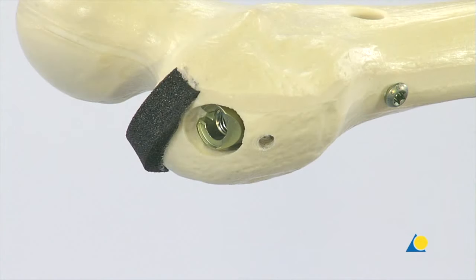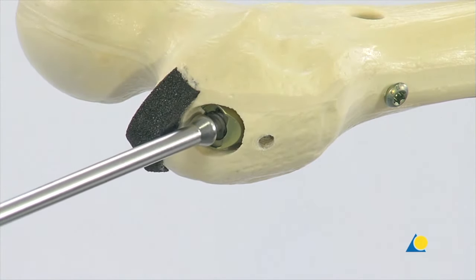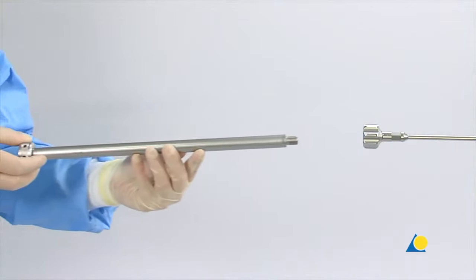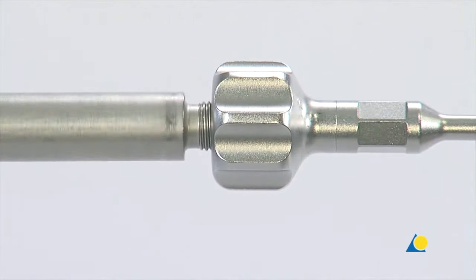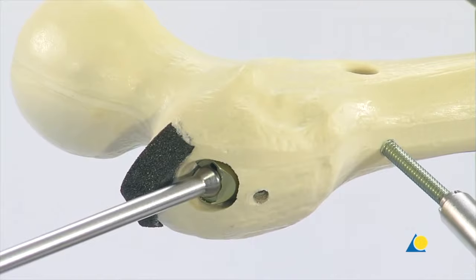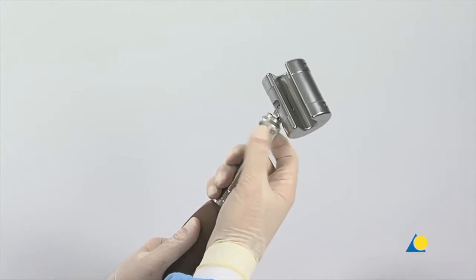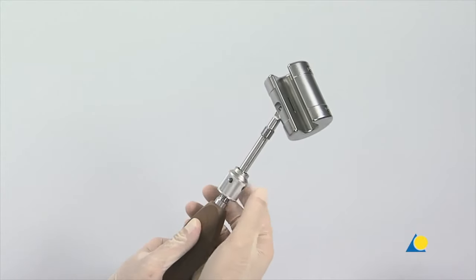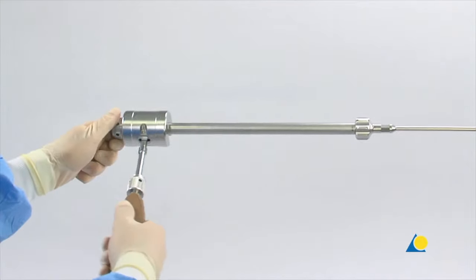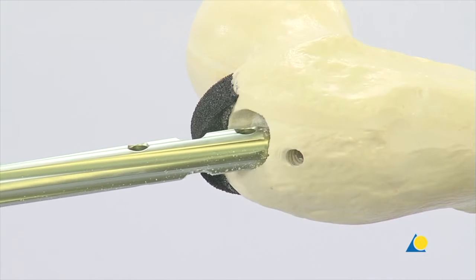The second proximal locking screw should be left in place to prevent rotation or displacement of the nail while the extraction screw is attached to the nail and tightened. The hammer guide is attached to the extraction screw. The remaining proximal locking screw is then removed. The head of the combined hammer is released by loosening the nut. The combined hammer is mounted on the hammer guide and the nail is extracted with gentle hammer blows. The LFN will rotate approximately 90 degrees from lateral to anterior as the proximal third is extracted.